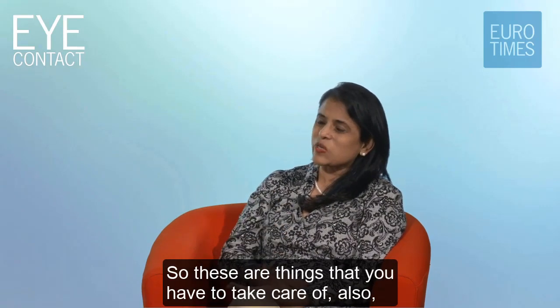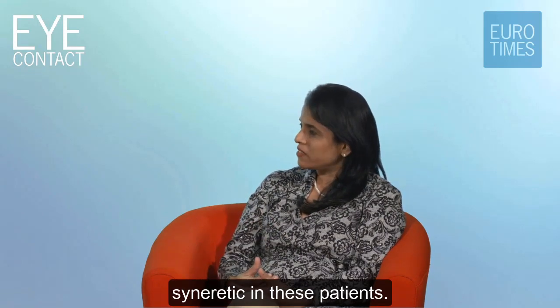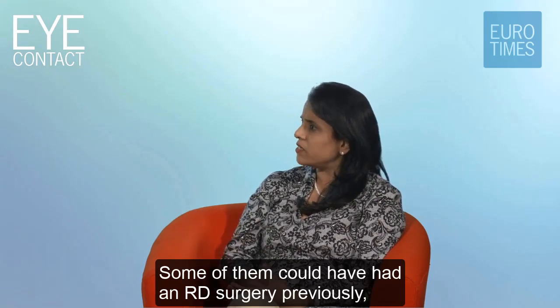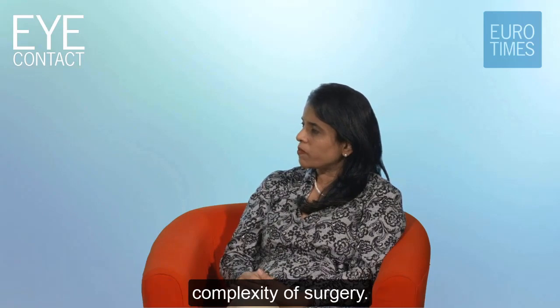So these are things that you have to take care of. Also, you have to remember that the vitreous can be syneretic in these patients. Some of them could have had an RD surgery previously, vitrectomy done previously. So these are all things that add on to the complexity of surgery.